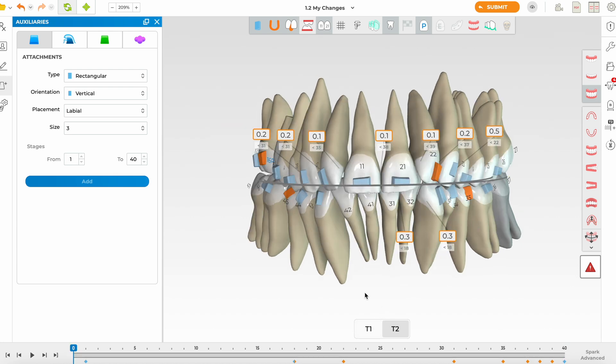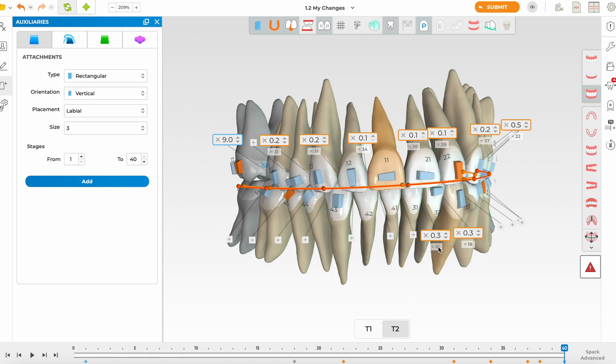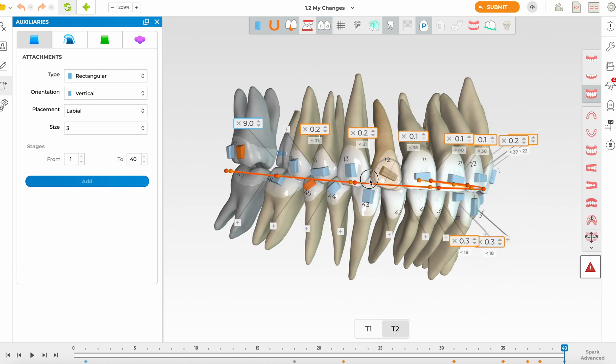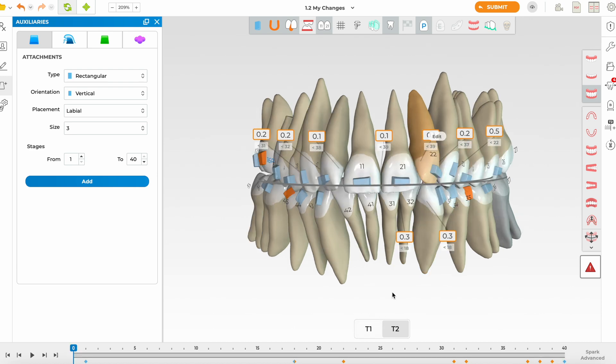Now for the vertical: they've intruded the upper anteriors moderately. I don't want too much intrusion because the patient is already showing about the right amount of incisors aesthetically. Some intrusion is needed when proclining upper centrals, but what's lacking is palatal root torque — a very unpredictable movement — so I'm going to increase it. For the laterals, I'll use horizontal attachments rather than vertical ones, as horizontal attachments are better for deep bite correction.